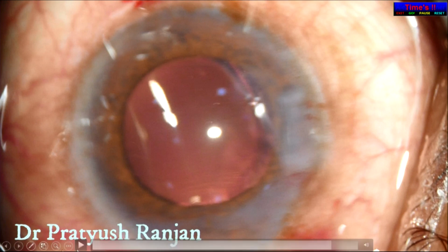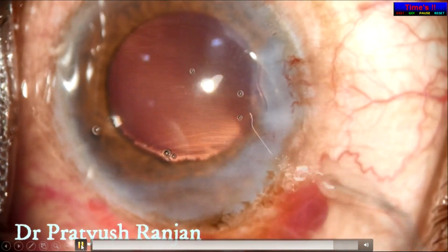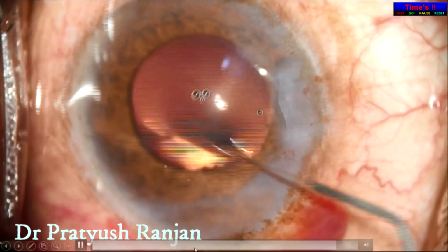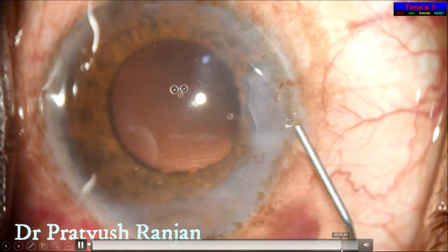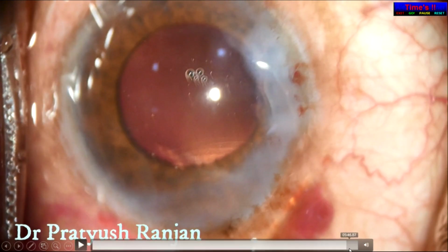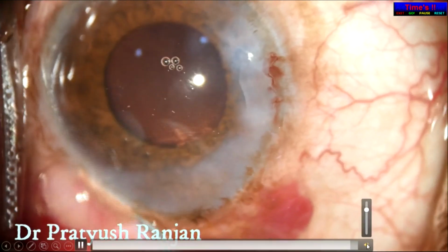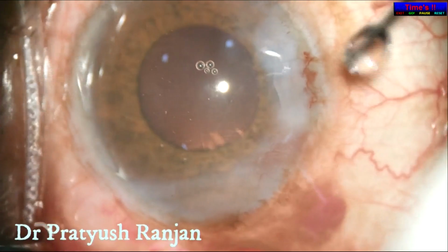And just see the last step. I think I forgot to show that. So this is how I am covering that conjunctival wound. The sclera is self-sealing. Injecting saline? Yes, sir. Don't inject antibiotic on this area.